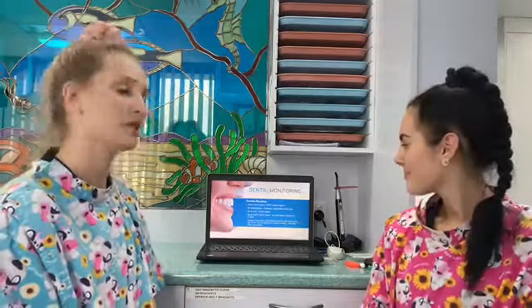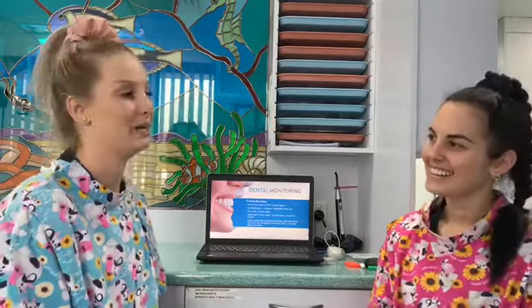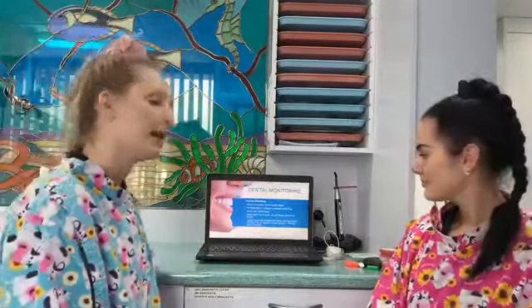So if you're not getting any notifications, just check that your app doesn't need a software update, or it might need to be reinstalled. Just making sure if you're not receiving any emails from us that you check your junk and spam folders as well. If you need any help, we're always just a call or an email away. So always make sure that you're scanning when prompted to and you're following the dental monitoring instructions.